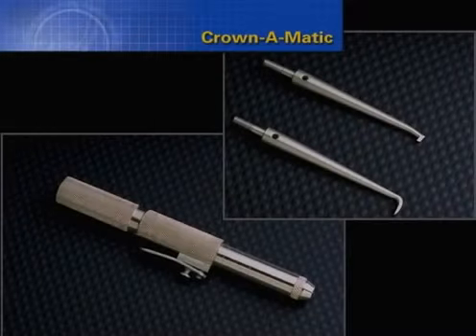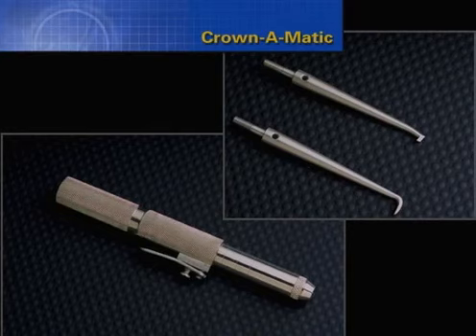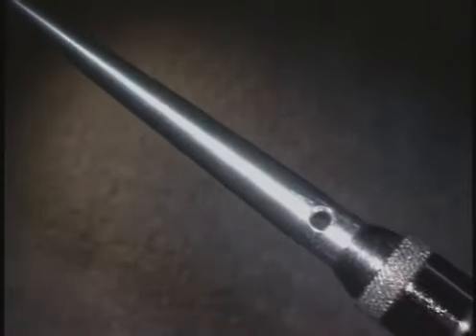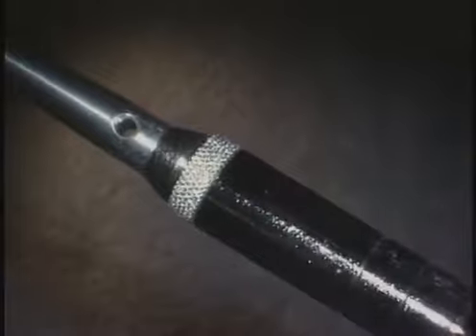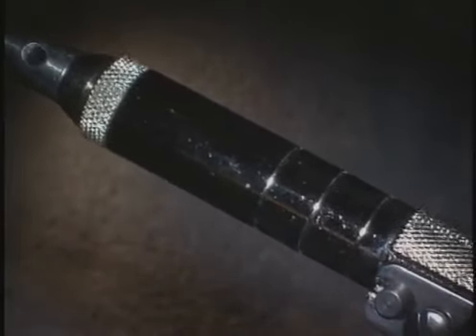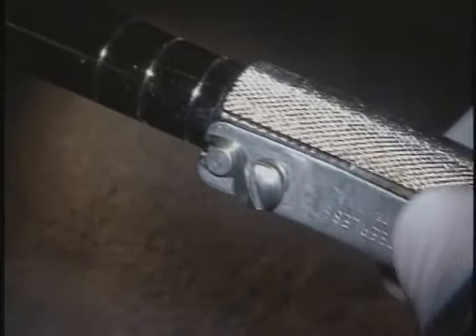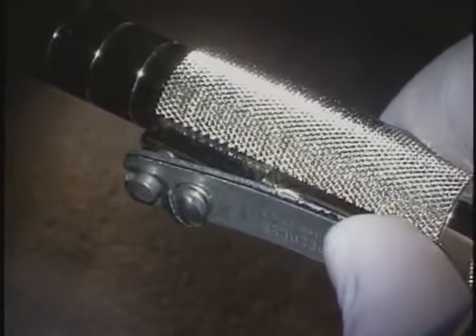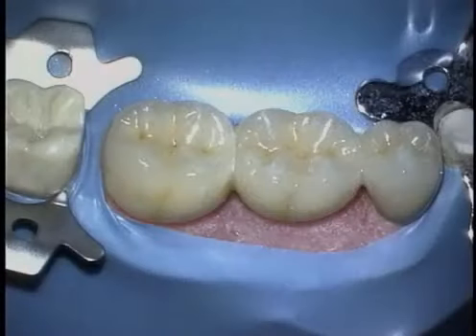The Crownomatic affords the clinician an innovative instrument and relatively reliable technique for removing fixed restorations. This instrument has interchangeable tip inserts and provides a technical advancement in crown and bridge removal. In this disassembly technique, the clinician selects a specific tip which is inserted and tightened. Three rings represent progressively increasing power intensities and can be selected by pushing the distal end of the instrument proximally. By compressing the trigger, the insert tip is activated and moves 1/2 millimeter.